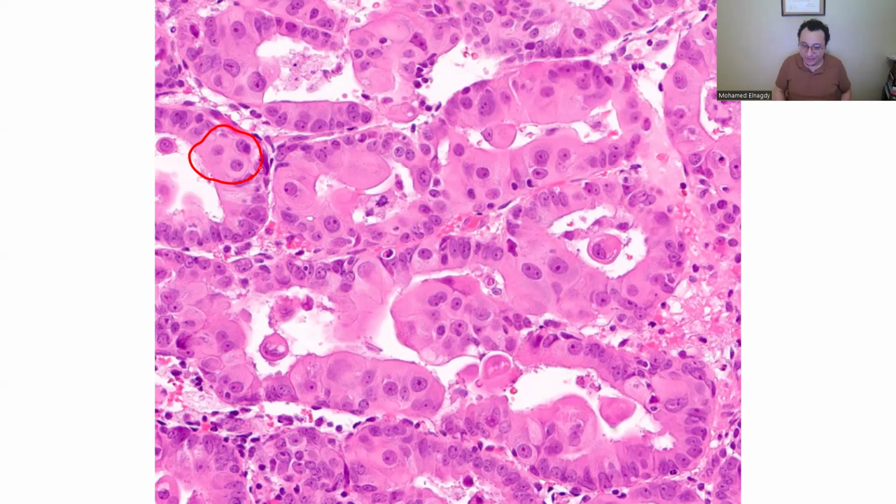That's squamous metaplasia. I know this is a really tricky picture, but you see these rounded, polyhedral nuclei? Some nuclei are rounded, some are polyhedral, but I always rely on these intercellular borders. They look like the squamous cells of the skin. They have these tight intercellular borders. That's squamous metaplasia of endometrial glands.